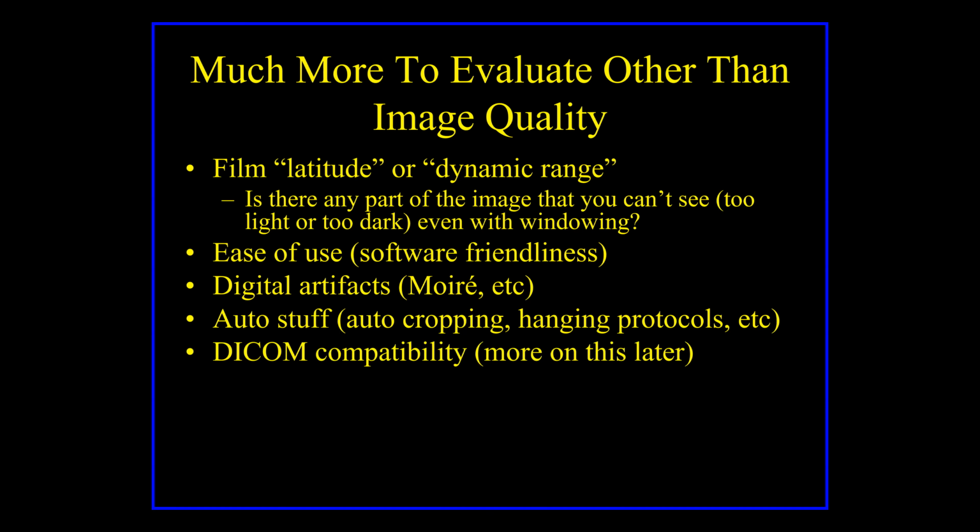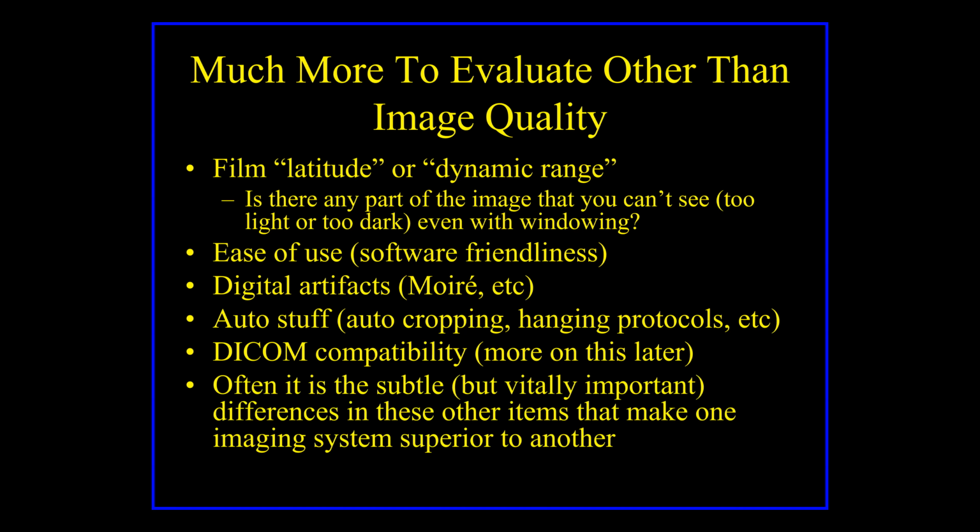The other thing that we have to talk about is this new word here called DICOM. Anybody heard of DICOM? Raise your hand. Yeah, DICOM is super important, and you have to make sure that whatever machine you're buying is totally DICOM compliant, because DICOM is the way that images are sent out and transmitted around the world, in veterinary medicine and human medicine. So DICOM is very important.